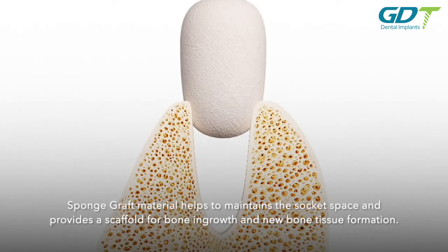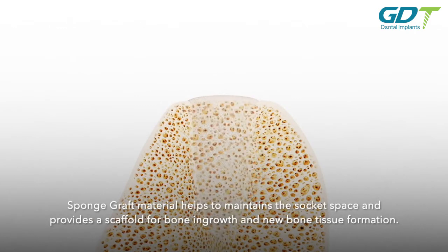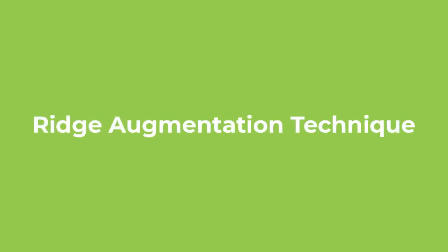Sponge graft material helps to maintain the socket space and provides a scaffold for bone ingrowth and new bone tissue formation.